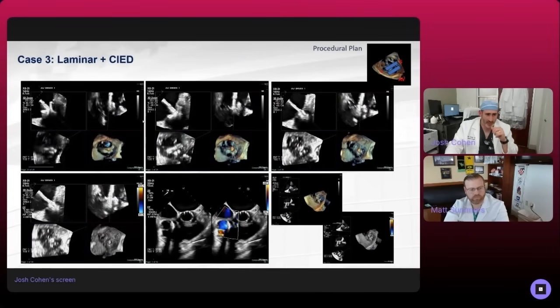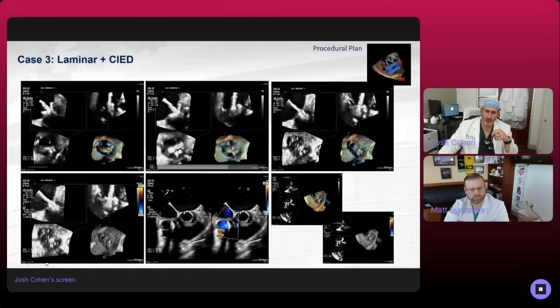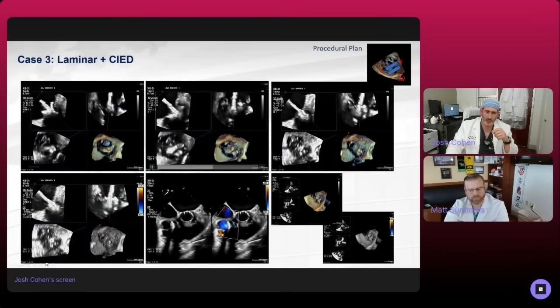And so we then decided to come in with a second clip just behind that first one, lined it up the same way we always do, came below the valve. Again, I'm aligned with our arms here, and so I can see really nicely at our green box, green line through the arms, green box. I can see the leaflets really nicely. We pull that together again, kind of really nice result.